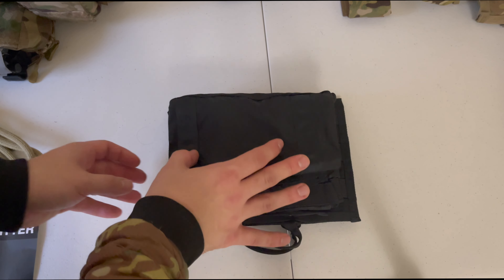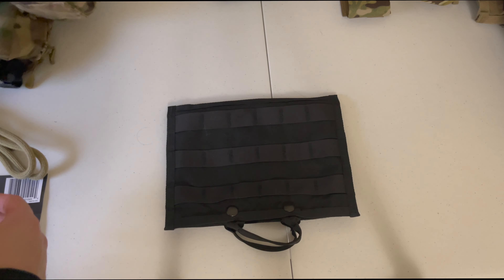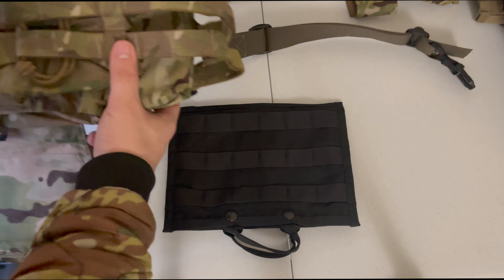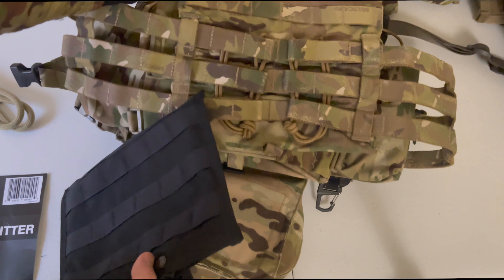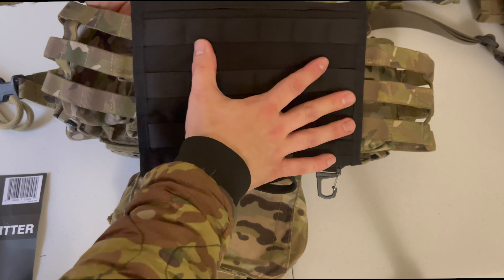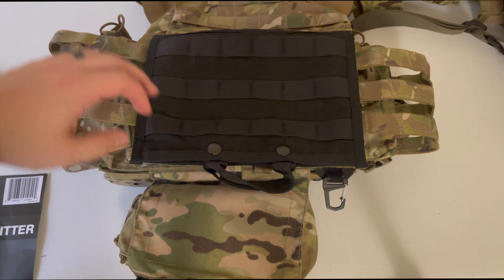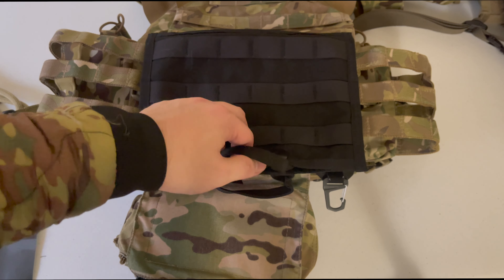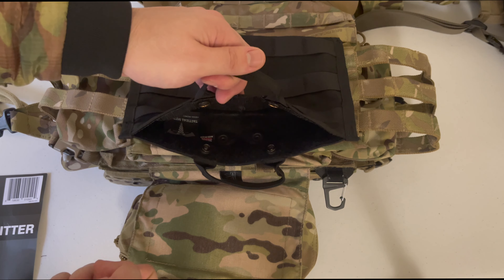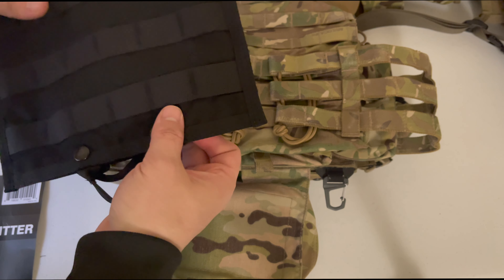You have a very small form factor. I'll show you the pouch here on the back of a Crye JPC for form factor reference. This is a medium Crye JPC with a medium ESAP plate, and it fits directly in the back. What you would do is blow it open and then pull the kit out to deploy that poleless litter.